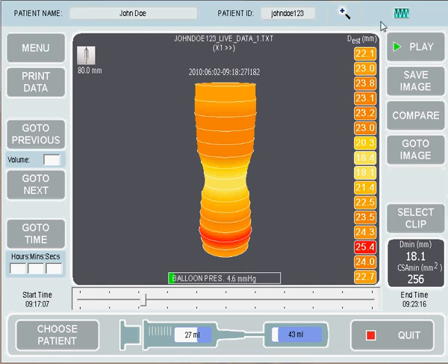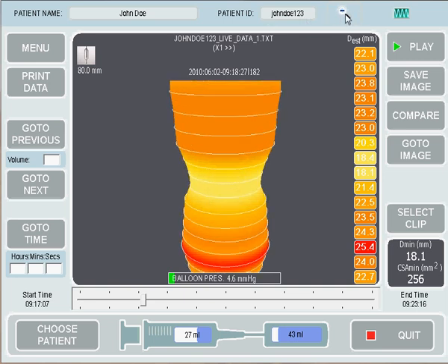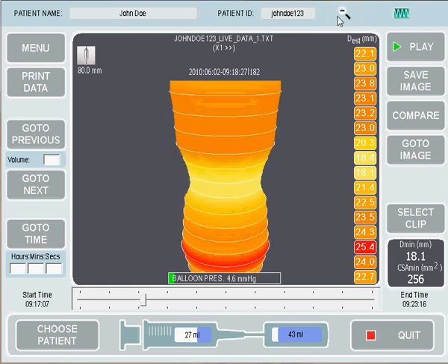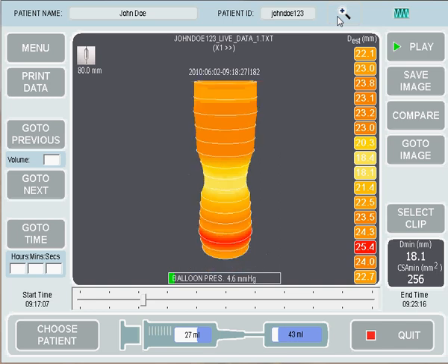Across the top of the screen, you'll notice that the patient's name is displayed, the patient's ID is displayed, and also a magnifying glass. This magnifying glass is used to zoom in on the image. So if there was a particular part of the image that you wanted to zoom in on, you could press that zoom and it would zoom in, and pressing it again zooms the image back out.